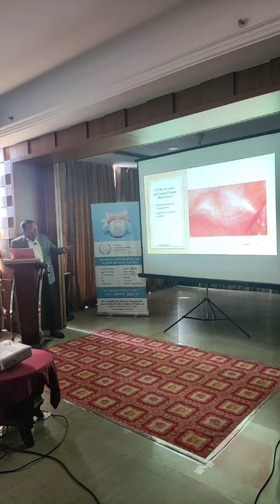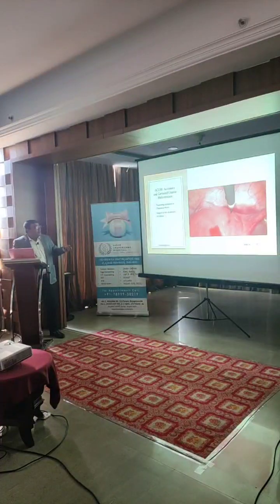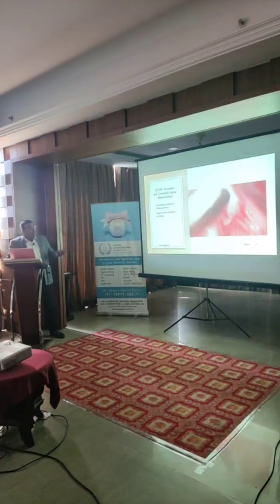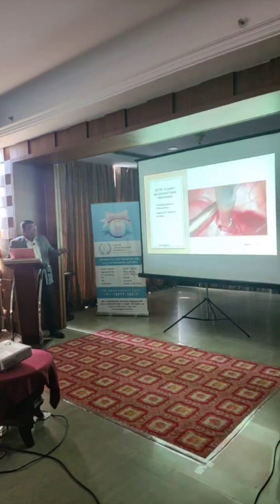I'm sorry for the poor video, because there was a problem with the rendering of the video. You can see this lesion here adjacent to the uterus. We just gave a little bit of vasopressin infiltration, and then with the hook we are giving an incision, and I can see that cystic lesion there.